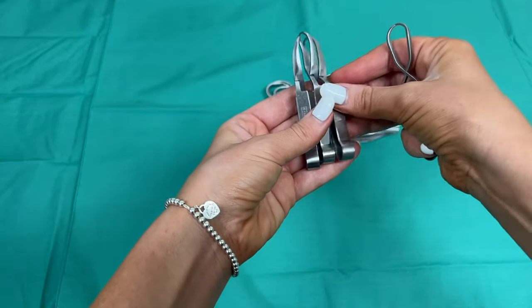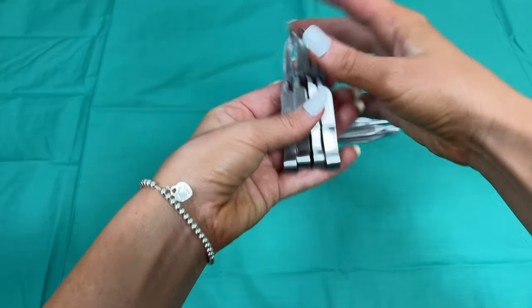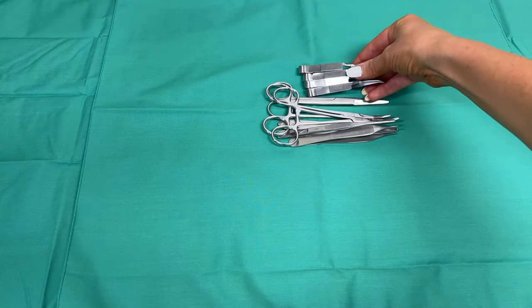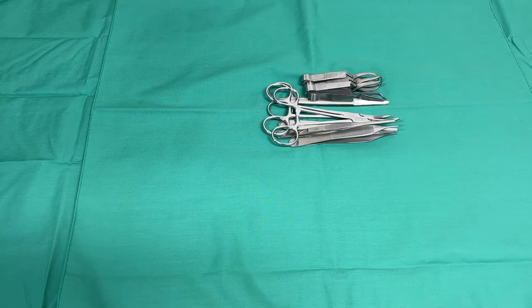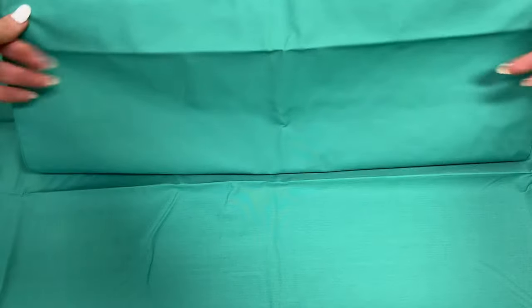Your clinic will vary on how they like their kits packed. The most important thing is that the packing of the kit is done in a sterile environment and that no external instruments, plastics, or debris ends up in the kit before you are closing it up.